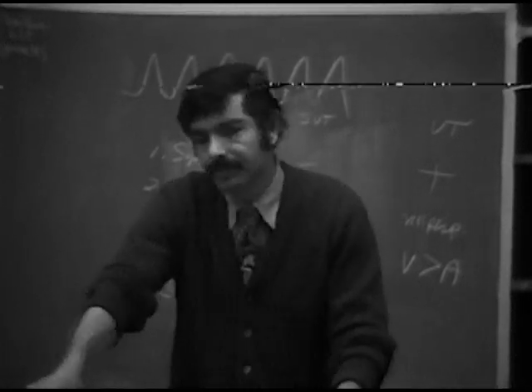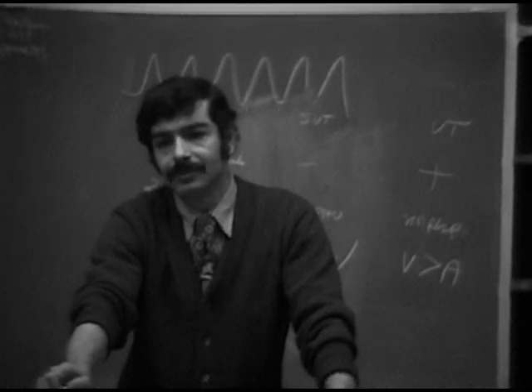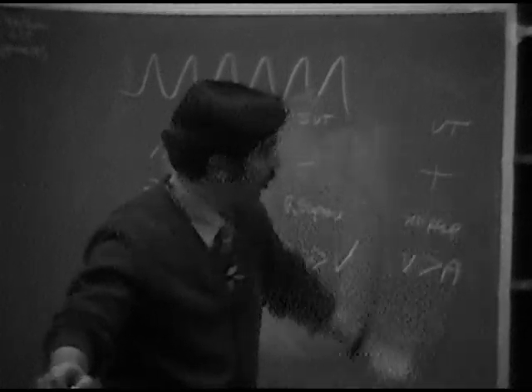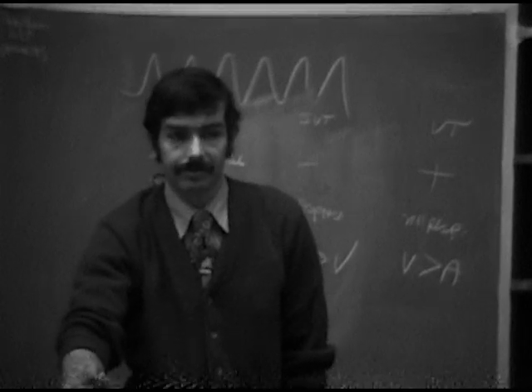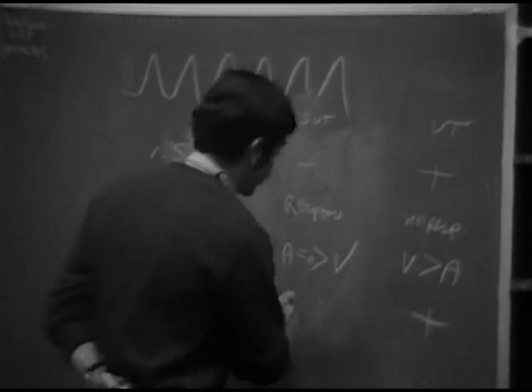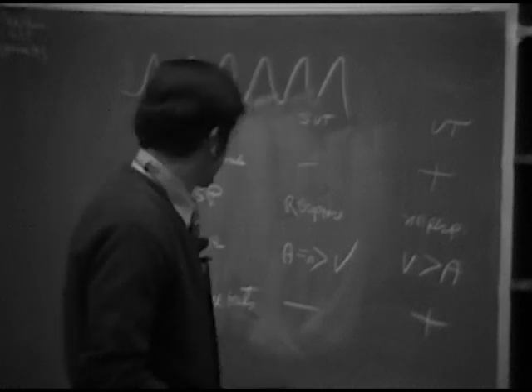Some conduction is occurring, and so you have AV dissociation. And again, AV dissociation, when you're trying to differentiate these two, generally means ventricular tachycardia in this setting. So the presence of capture beats implies ventricular tachycardia.